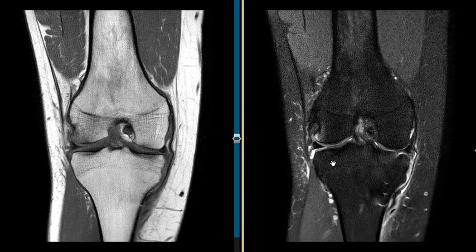And this patient also had one more finding over here. This is a little bone bruise on the lateral femoral condyle, and so the mechanism of injury was the tibia went out this way, which really stretched these tendons and ligaments, or this one ligament and these tendons, and caused the injury over here, and then it impacted over here. So the tibia impacted with the femur, has a little bone bruise.